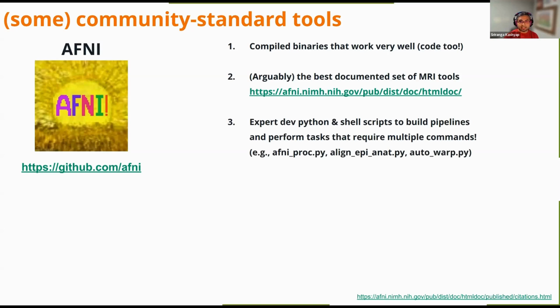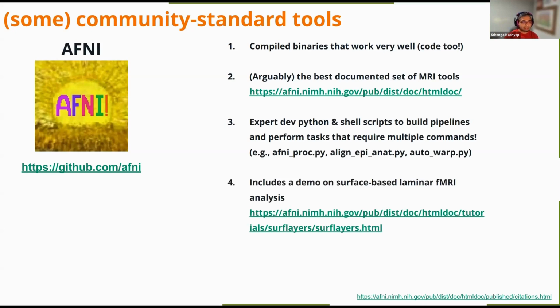Another reason why it might be very appealing to some people is that it has expert-developed Python and shell scripts that can help you build pipelines. And you can perform tasks that often require multiple commands and exact knowledge of what needs to be input, what needs to be output. Am I giving it the right file? With these Python wrappers, all these things are made easy for you.